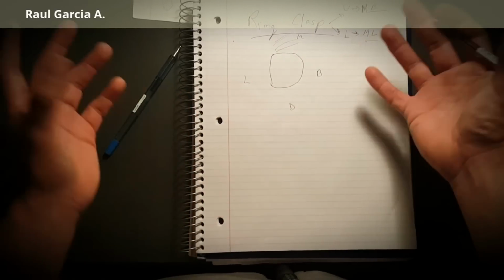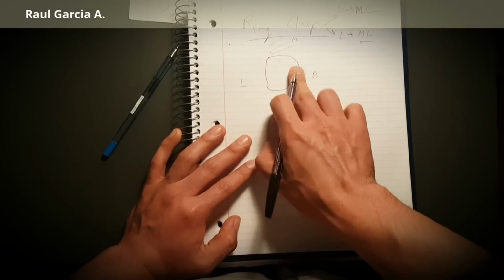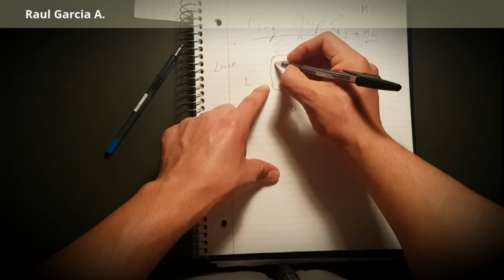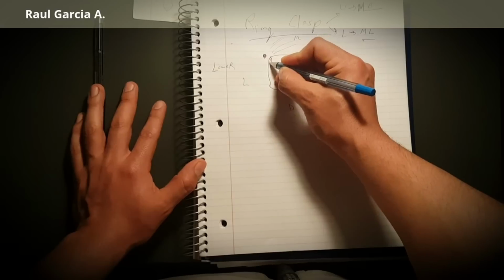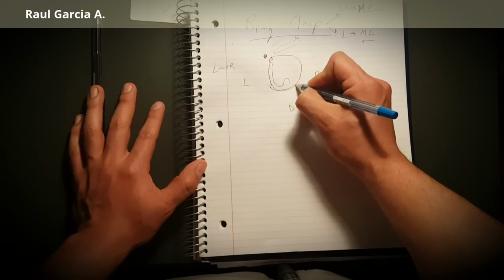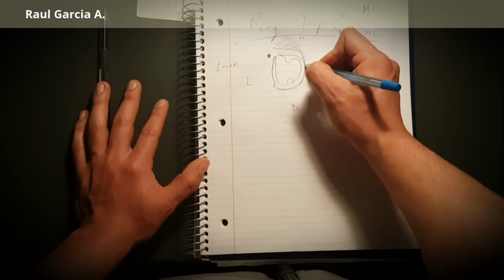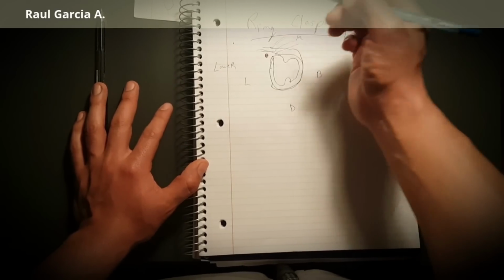So what does it mean? How is the design? Here, this is the lower arch, okay? So we want to engage a mesial lingual undercut. We want to engage here, at this point. So you're going to start there. You go here. You're going to have one rest. You continue all around. You have another rest. There we go. You have your guiding plane here included, and it follows the rest of the structure.